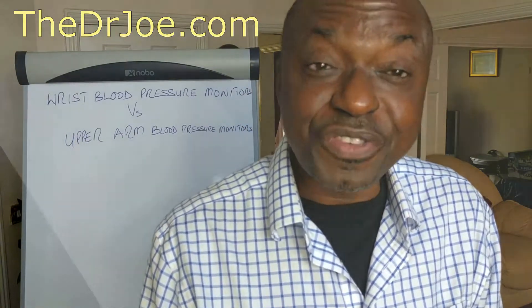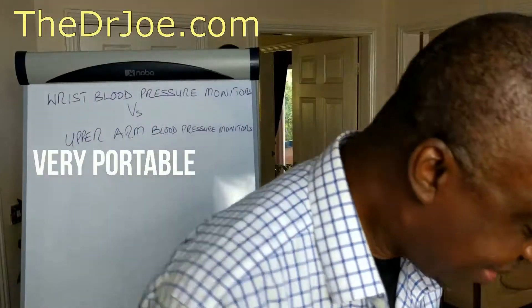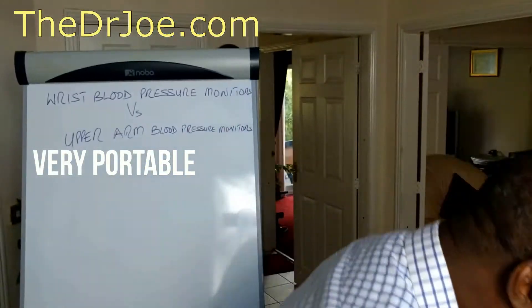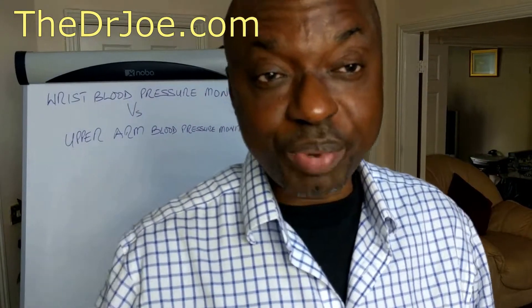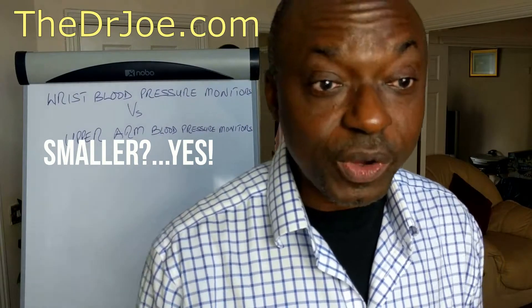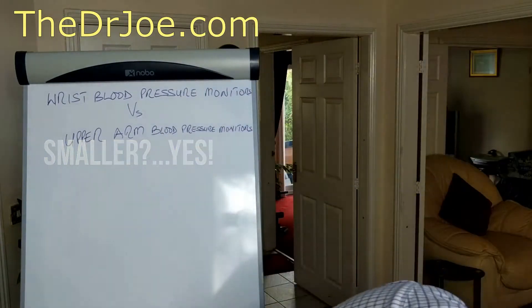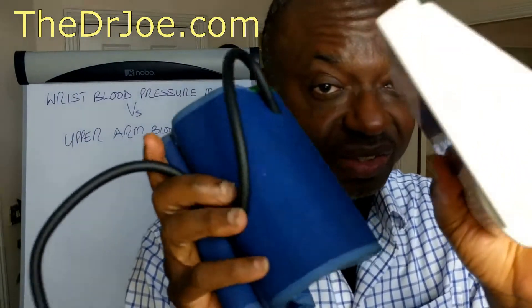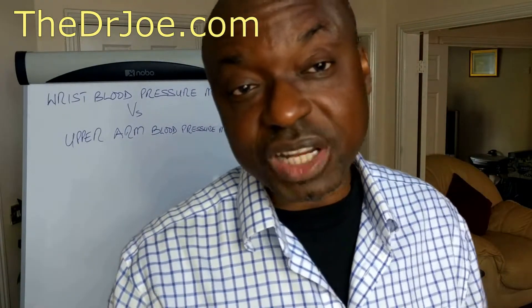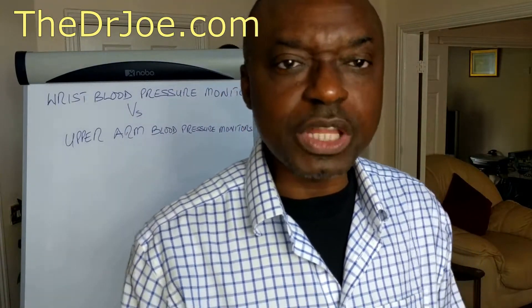The second positive is they are very portable because they are smaller than the upper arm monitors. They're very easy to fit into your bag and off you go. If you're traveling, you can take them along with you. That is not to say the upper arm monitors are bulky — they're also easy to carry around — but in comparison, the wrist monitors are smaller.